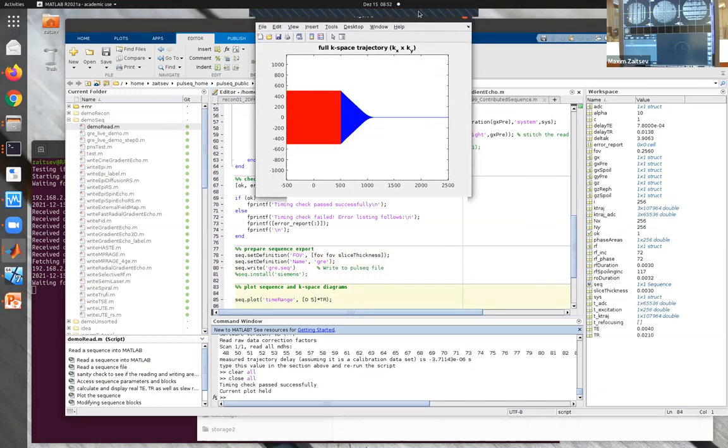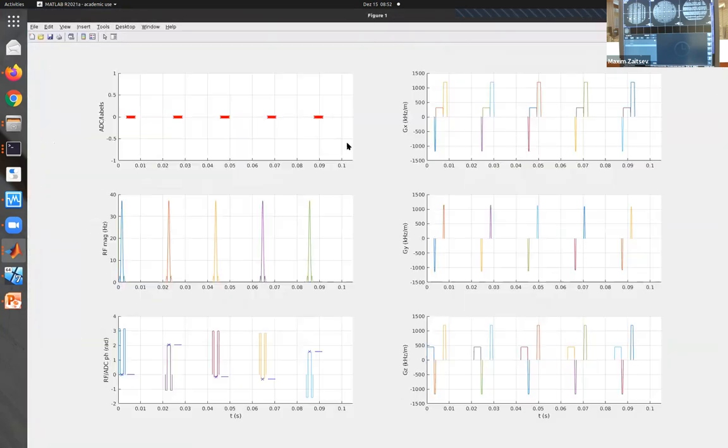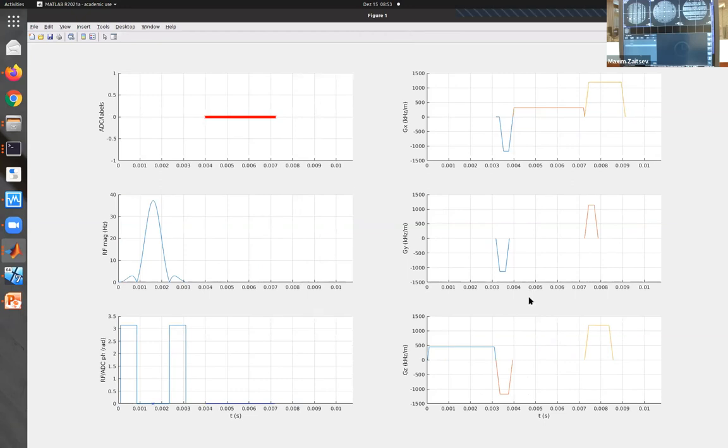So here's the beginning of my sequence. Let me see. So that's the timing. And again, the timing window shows the ADC events, the RF pulses, the RF phase, and the gradient pulses on every axis. And you can nicely zoom into the timing to see more of the inner life of your sequence, okay?